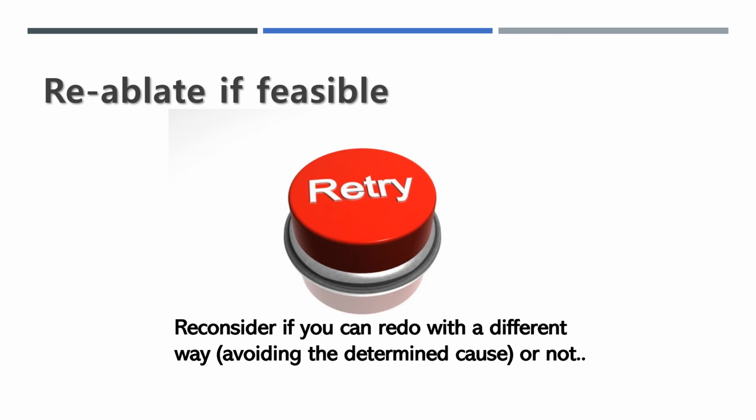In summary, mistargeting can be minimized by careful selection, precise placement of electrode, careful monitoring, and final assessment before finishing.